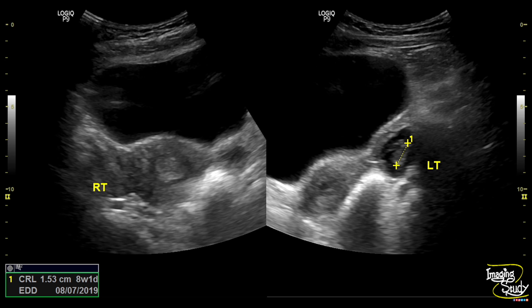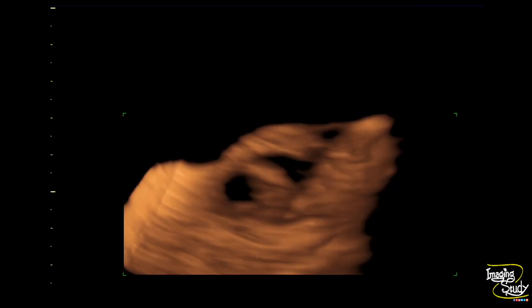Here we have measured the crown-rump length of the embryo, which was 15 millimeters, corresponding to eight weeks and one day of gestation. However, no cardiac pulsation could be detected. For further evaluation, we have taken the 3D ultrasound of the lesion. You can see the gestational sac, and inside it, this solid part is the embryo.